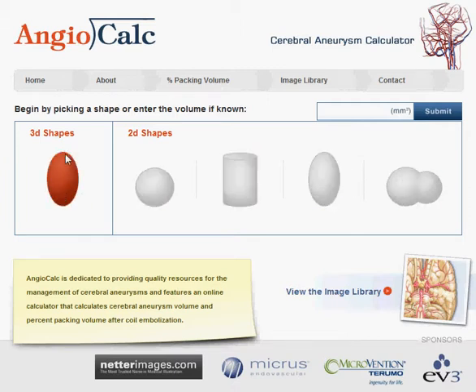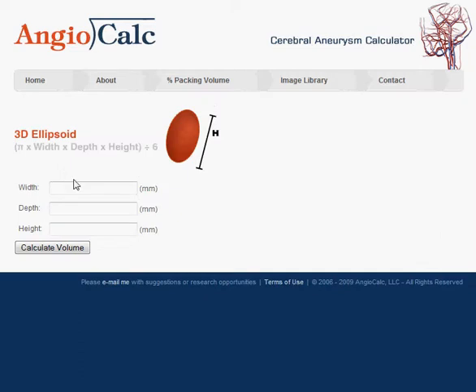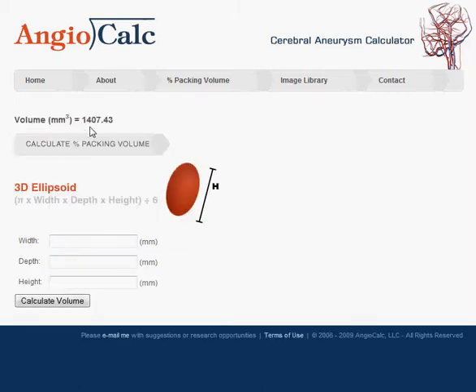If you have all three dimensions, this will be the most accurate. Enter in your dimensions here and click calculate volume. This gives you the volume of the aneurysm, and you want to take that volume to the percent packing volume page by clicking here.